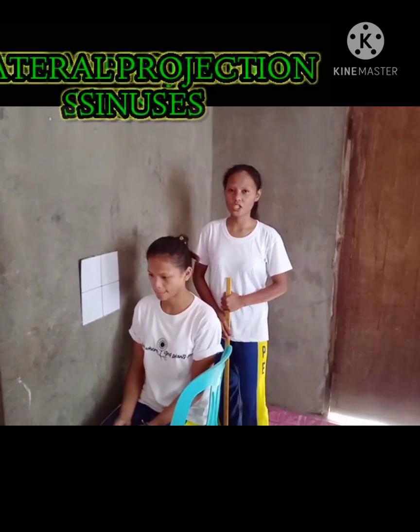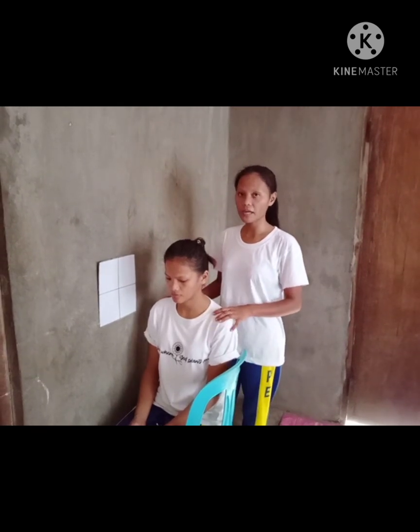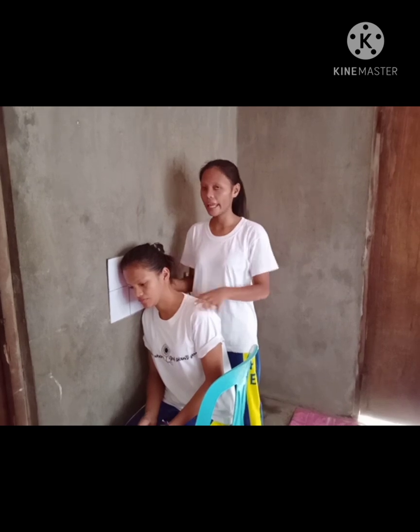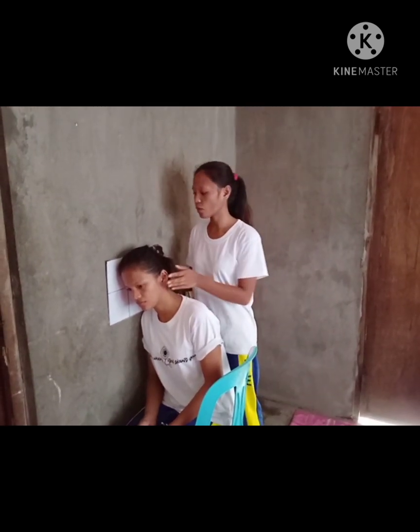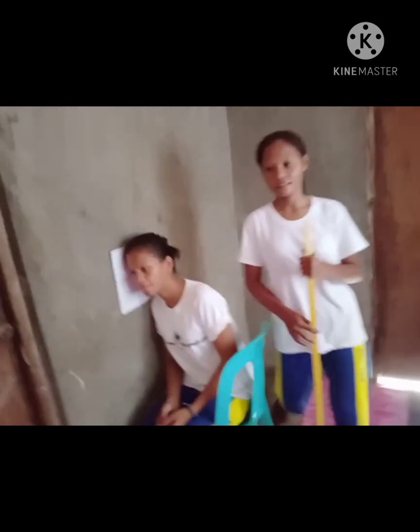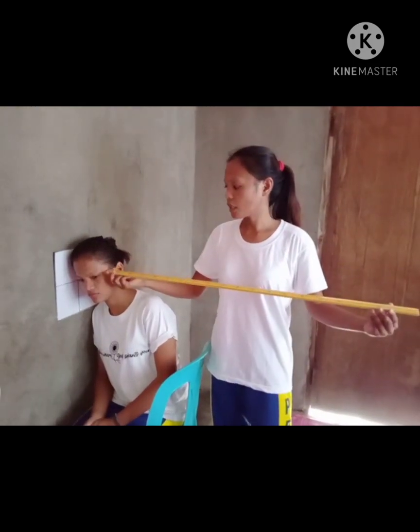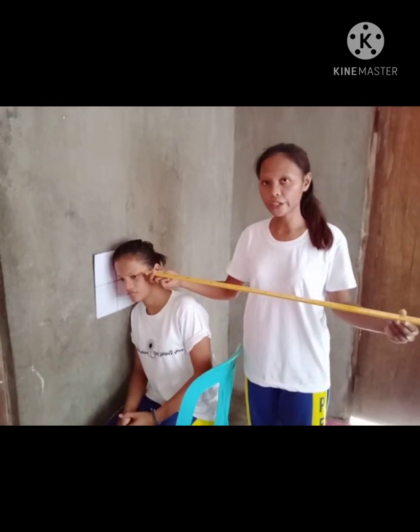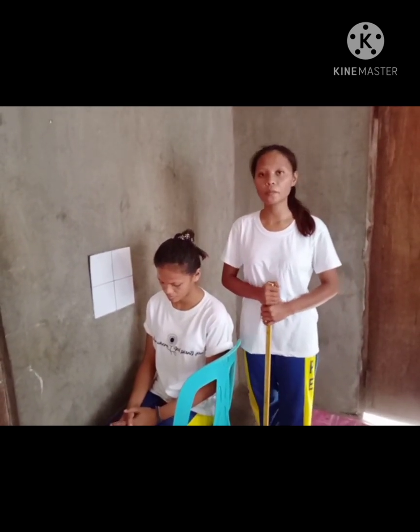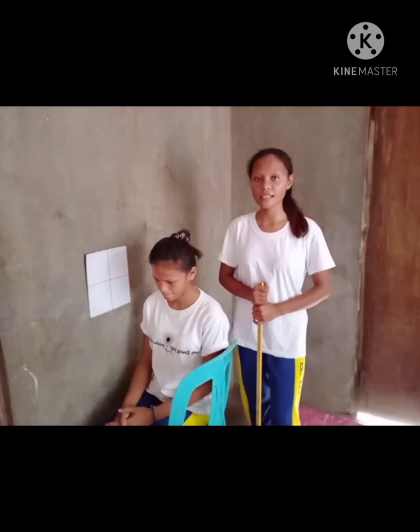We have the lateral projection. In this lateral projection, the patient must be in seated upright position. The patient's head is in contact with the IR, LAO or RAO, like this, attached to the IR. The central ray must be directed horizontal to the patient's head, one half inch posterior to the outer canthus. It shows a symmetric image of the anterior portions of the base of the skull and sphenoid sinuses, and the ethmoid air cells are shown.